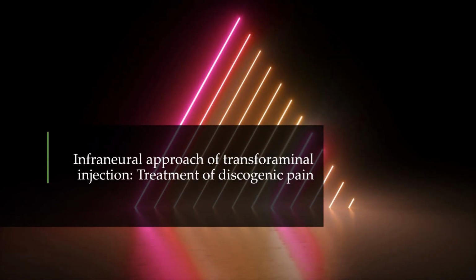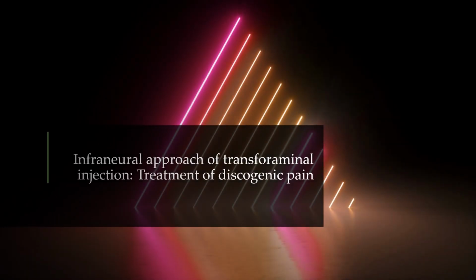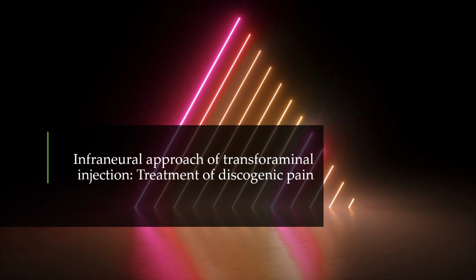Welcome to today's session, which focuses on the technical demonstration of the infraneural approach for transforaminal injections, specifically in cases of lumbar discogenic pain. We have previously delved into various types of transforaminal injections and their indications. However, some practitioners still question each technique's specific details and suitability. So today, we'll zero in on the intricacies of the infraneural approach, illustrated by a recent case of discogenic pain, complemented by a technical video for hands-on understanding.